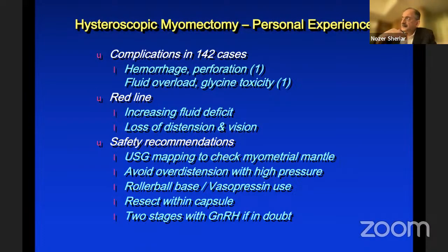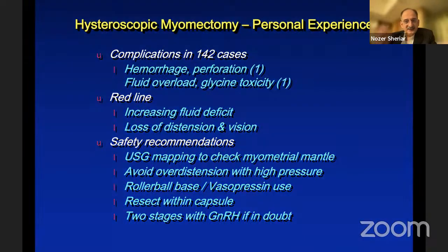I have known about a case many, many years ago where there must have been a perforation. There was bleeding. Another senior gynecologist stepped in, put in a Foley's bulb, thought that they solved the problem until they had to do a laparoscopy or a laparotomy. And there was this 30 ml bulb and the uterus was literally split in two. So just 5, 8, 10 ml. That's what a gynac uterus requires.